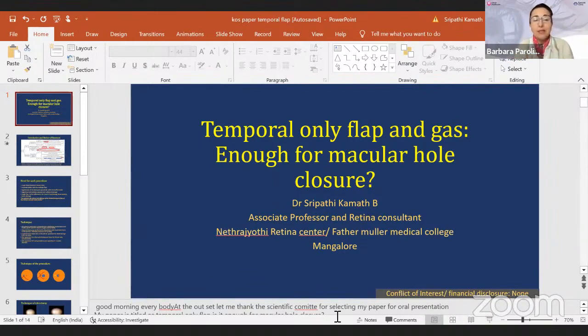I'm doing that in persistent macular hole after the first surgery. I'm adding the macular buckle just because in high myopia, when you manage the macular hole, you can close the hole, but you could detach the macula. So my favorite technique is to hydrodissect the macula with injection of subretinal BSS, placing a macular buckle and closing the hole over the top, even without anything inside. I think that's the only way to achieve a functional improvement as well.